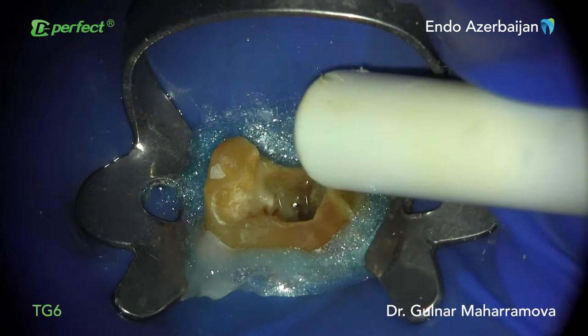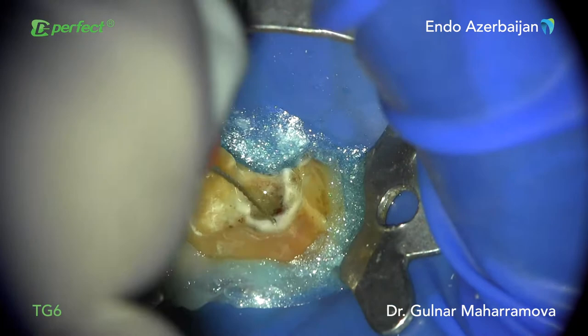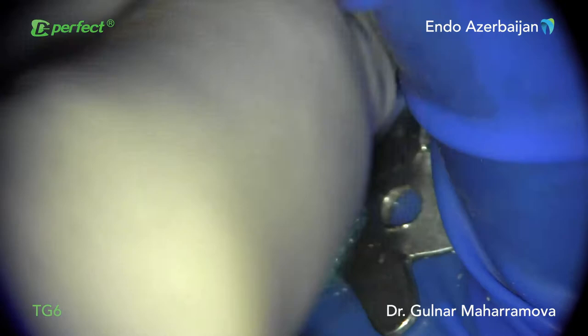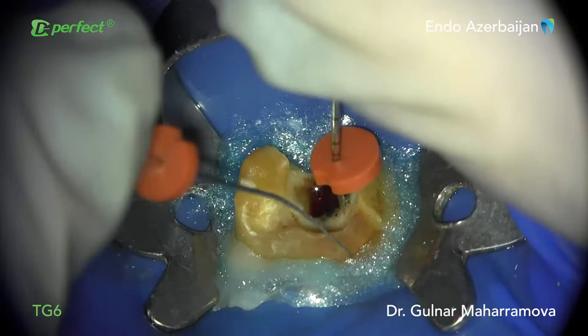The next step was to scout and to establish a glide path, as well as to obtain a working length by using an electronic apex locator. The X-ray was taken to confirm the readings of the apex locator. 5.25% sodium hypochlorite is used throughout the shaping following each file to wash out debris and disinfect the root canal space.